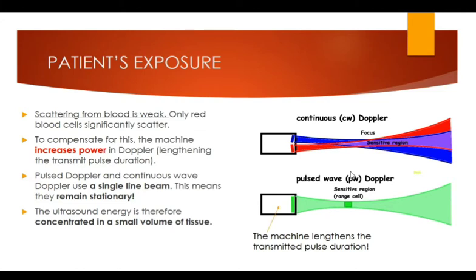What I mean by that is we're stretching them and contracting them, over and over again. When you do that repeatedly with ultrasound, you create heat in the body. You need to keep that in mind, which is why we don't expose little embryos to pulse wave and continuous wave Doppler. We really need to remember that when we're using Doppler.